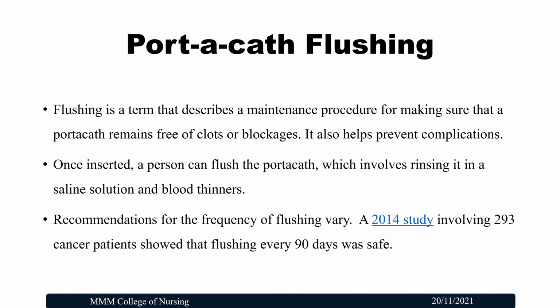Port-a-cath flushing. Flushing is a term that describes a maintenance procedure for making sure that a Portacath remains free of clots or blockages. It also helps prevent complications. Once inserted, a person can flush the Portacath, which involves rinsing it with a saline solution and blood thinners. Recommendations for the frequency of flushing vary. A 2014 study involving 293 cancer patients showed that flushing every 90 days was safe.